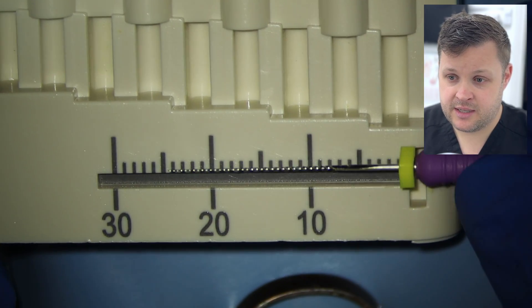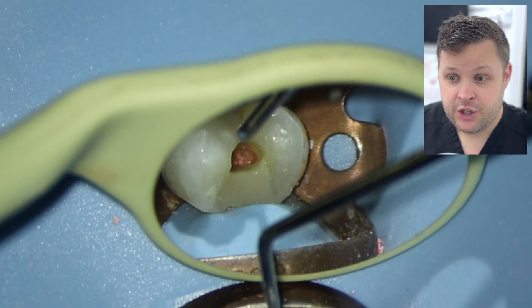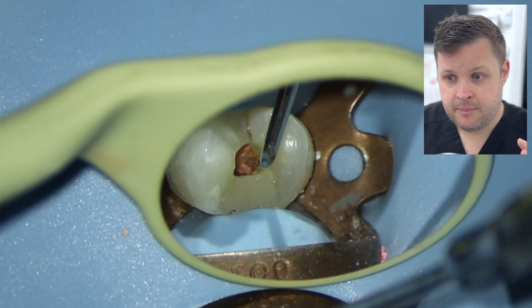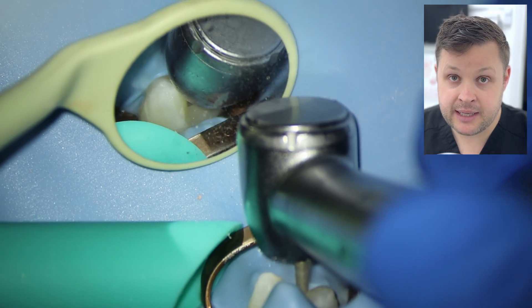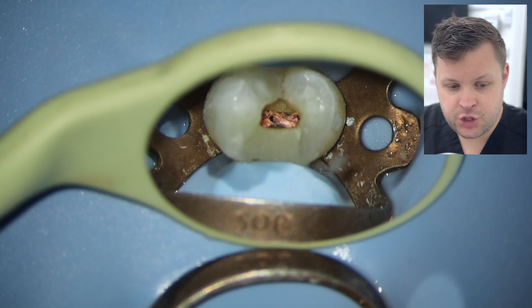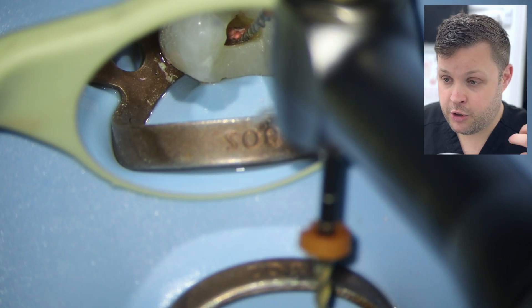I use an ultrasonic to remove some dentin and reveal much more GP — there is clearly another canal space. I'm going to try to get the working length of this canal. I should note that where we place the rubber stop is somewhat arbitrary: the palatal canal has a longer working length, but it joins onto the buccal — and that's because the palatal cusp is much higher than the buccal. I'm refining the access so I can get into the palatal canal, because if access isn't open, GP can ledge under dentin or pulp chamber roof.